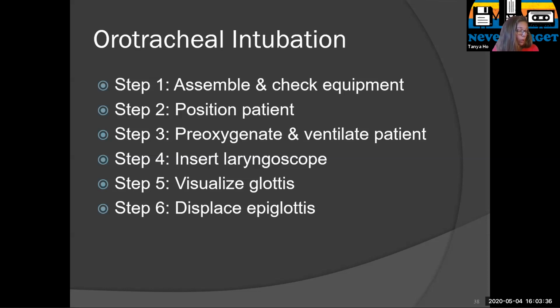You're going to need suction equipment ready. You're going to need your manual resuscitation bag with a mask. And obviously your oxygen source, because initially you're going to bag the patient until they're ready for intubation. You may or may not bag, and then you will need your syringe and your stylet. You're going to need a way to detect whether it's in, so an end-tidal CO2, either a monitor or just the capnometer, the little color changer.